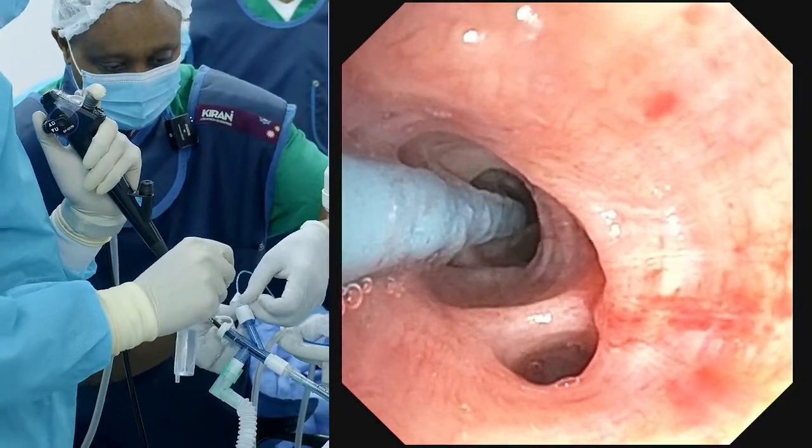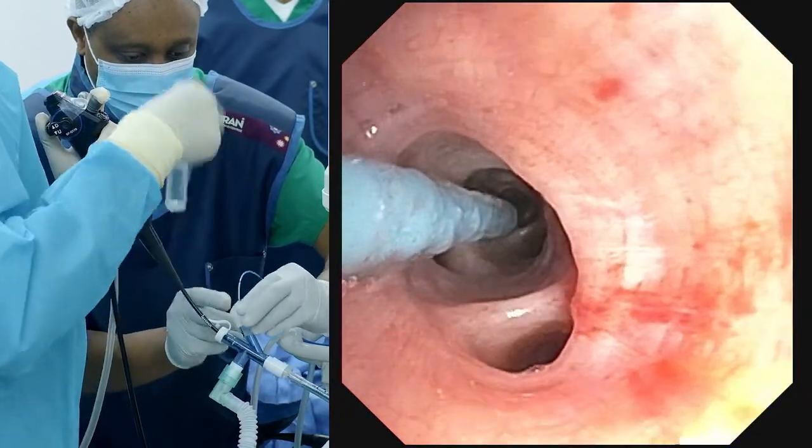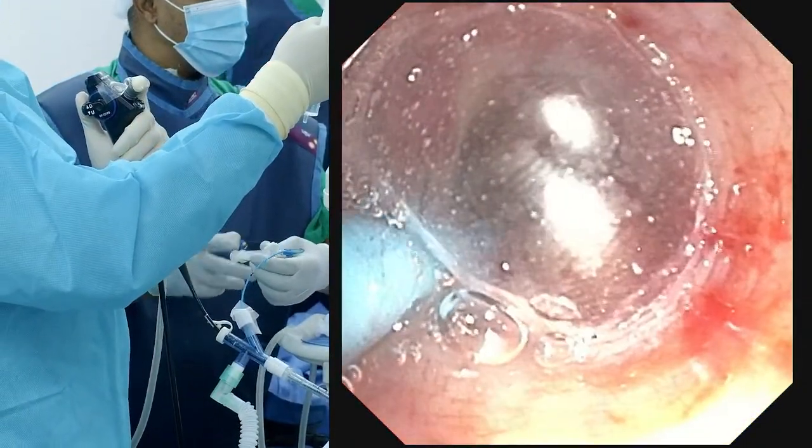You want to put it a bit deeper, because it moves a little bit. And then we can work with it as we do it. You're good. You can see where I am on the fluoroscopy. Yeah, that's good.